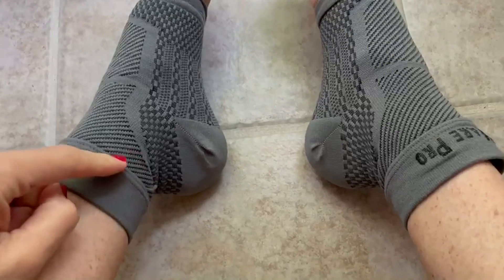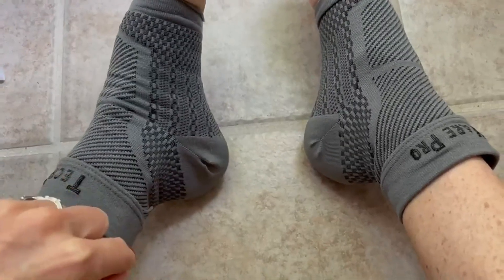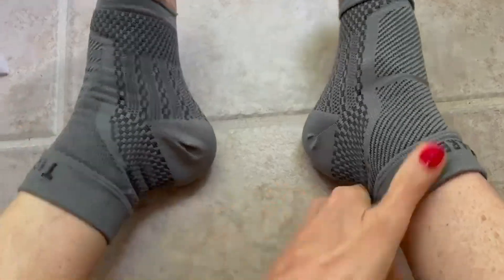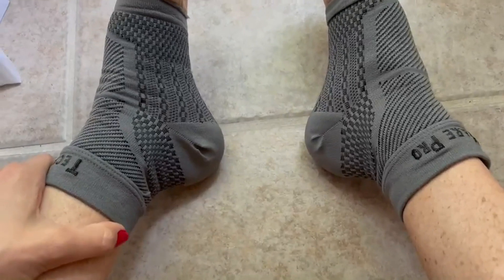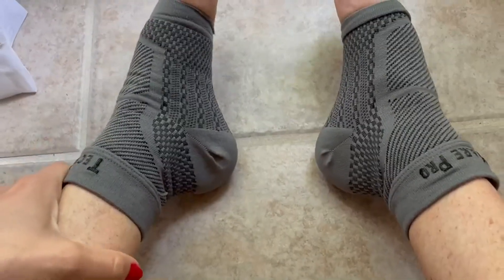We were going on a hike and I had just started running again after taking a break. My ankles felt weak and I felt a little wonky in the Achilles heel area, and they worked wonderfully. I wore them for probably two to three weeks until I felt like my strength was back.